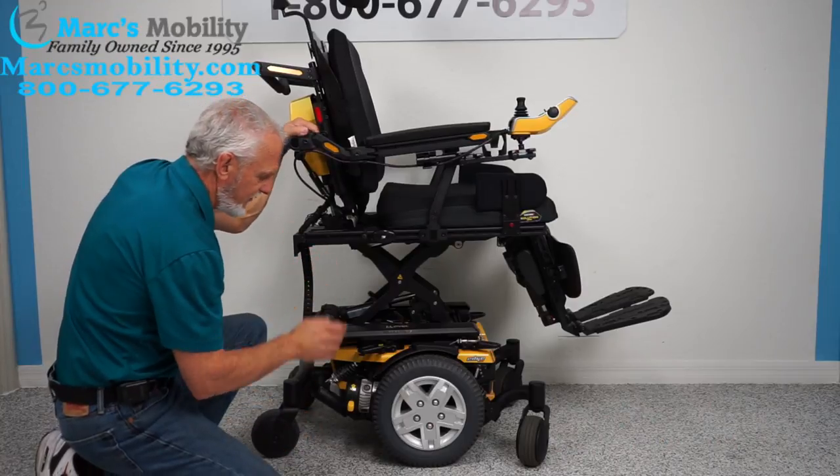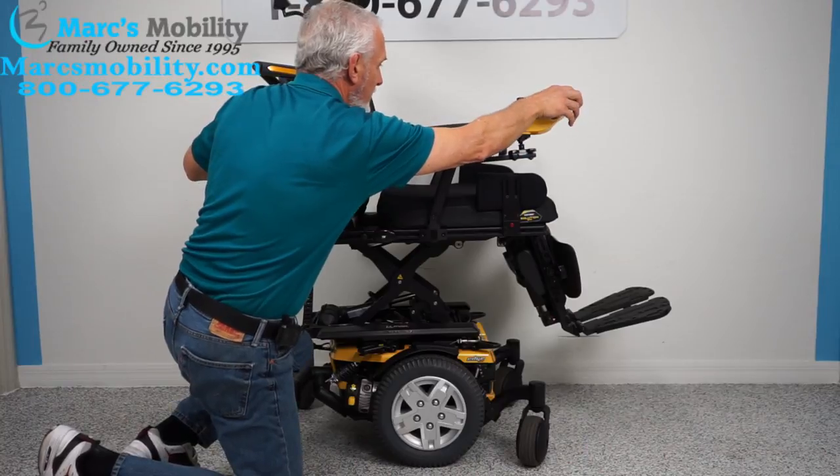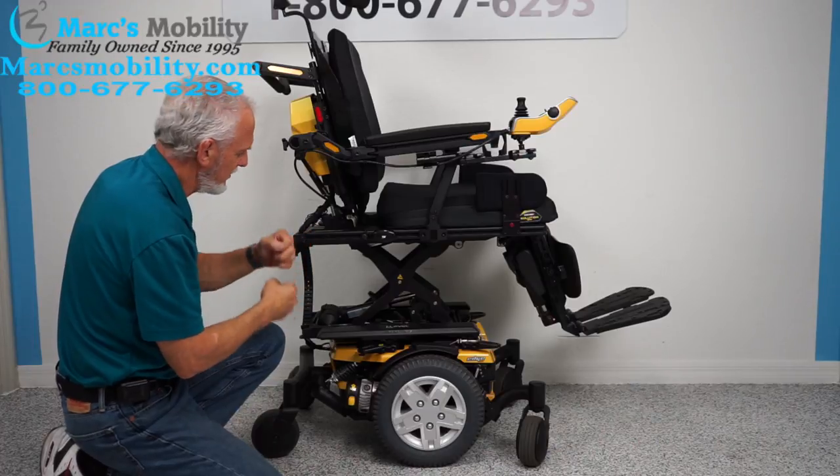When you're done, do not forget to put it back in gear, then you can turn your power back on. The reason you want the power off when you put it in neutral is you want no resistance in the motor.